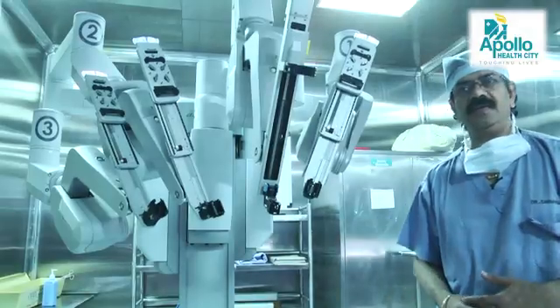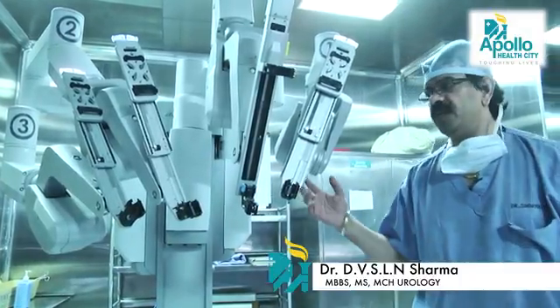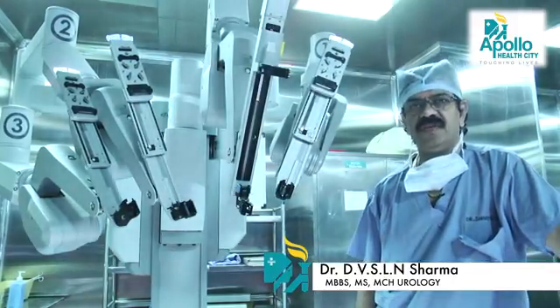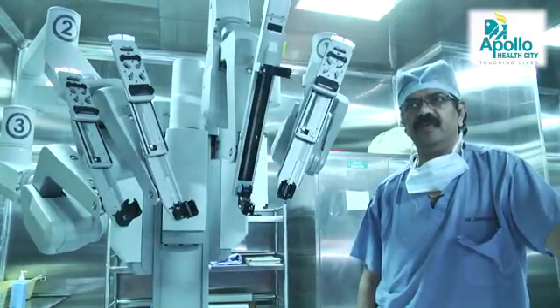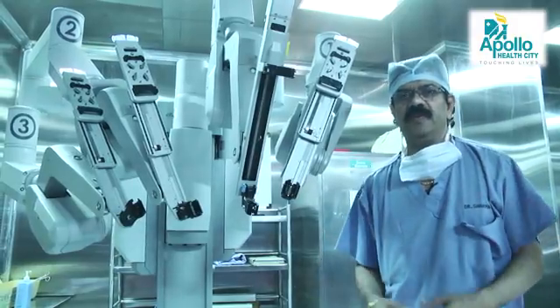I am Dr. Sharma, Senior Consultant Urologist, Apollo Hyderabad. We acquired the robotic machine in 2012 in the last quarter and we have been performing robotic procedures. All the procedures that were previously performed either in open or laparoscopic surgery have now been performed by this robot.